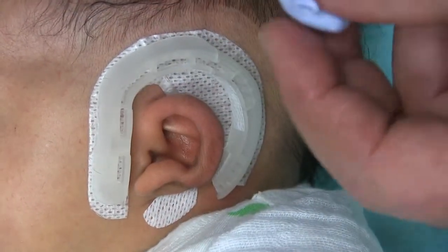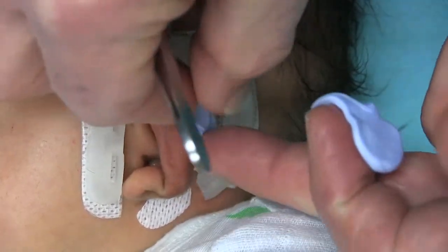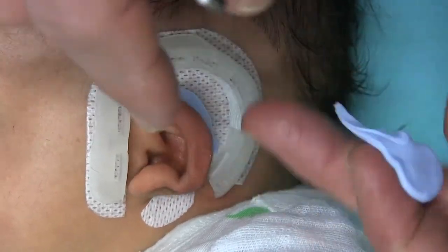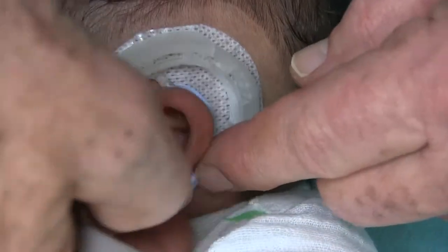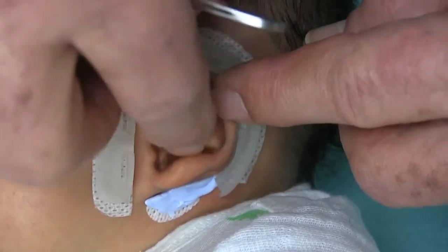Good job, buddy. Let's do this. You just have to cry it out. I know. He's like, I give up. These people won't listen to me. He's not listening to me anyway. These people are crazy with bad ears. I don't understand it. But they're just not going to leave them all on, so — might as well settle in.